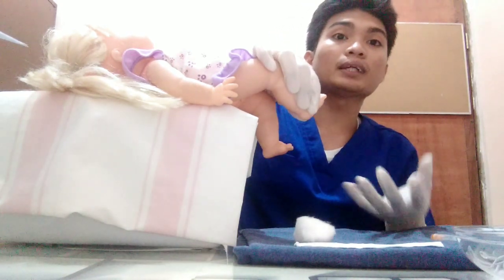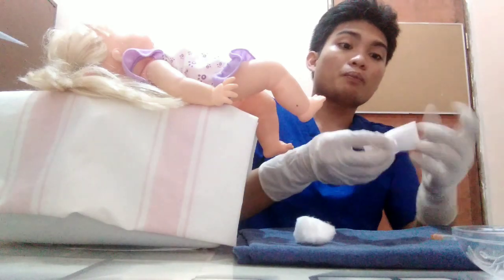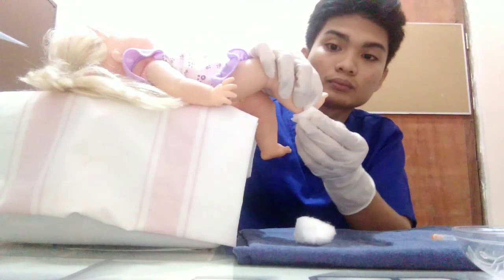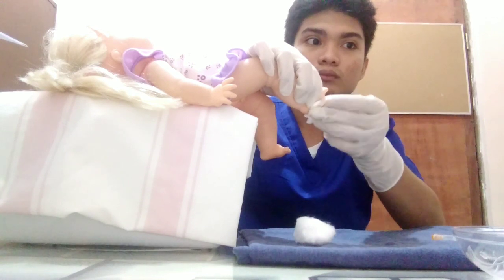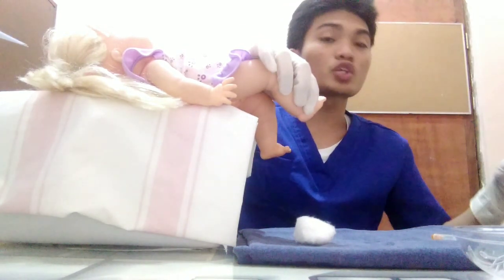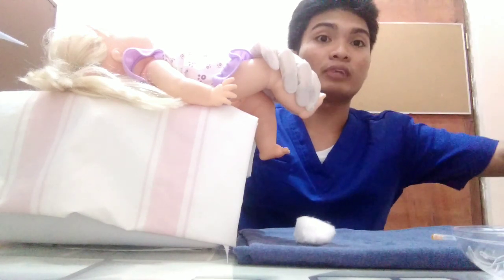And we have to remember that the first blood flow that will come out on the periphery or in the heel of the baby should be wiped off using a sterile gauze. Now, the second drop of blood, that would be the time that we will be using our filter paper.